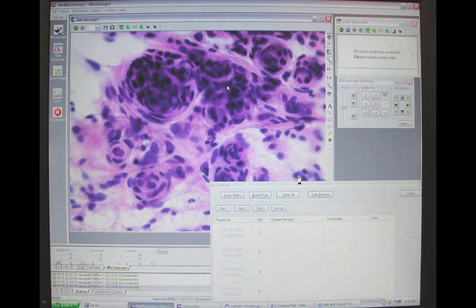As long as you know the proper IP address to log into, you can control this from any broadband connection anywhere in the world. You can do it on a tablet computer if you wanted to. You can control that microscope by remote through these special keys on the website and look at the tumor in real time. You control magnification, control the location, and you can see these whorls all over the place. For example, in this case, which is a meningioma.